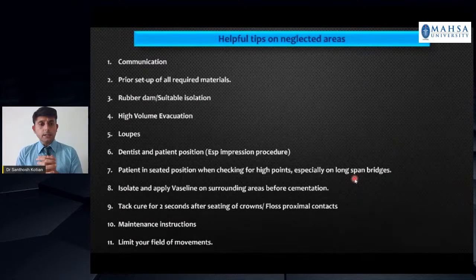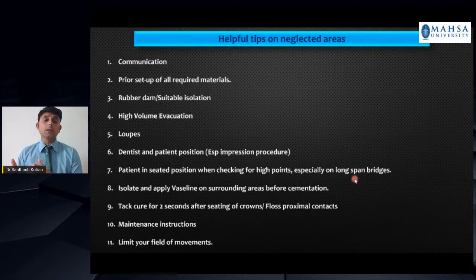Loupes, definitely, I would recommend, but it takes a while to get used to them. If you've never used loupes during your undergraduate program, then you can start going towards it. It gives you a better visualization of the tooth prep, better visualization of the surface finish of your tooth prep. It definitely helps you in getting better tooth preparations.